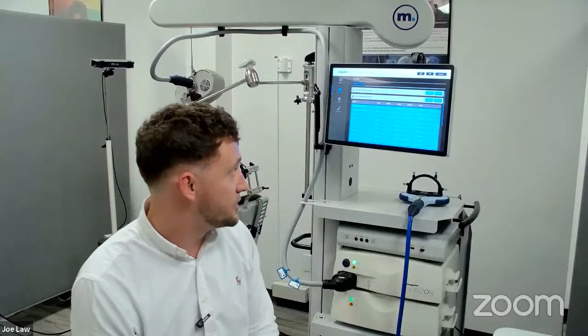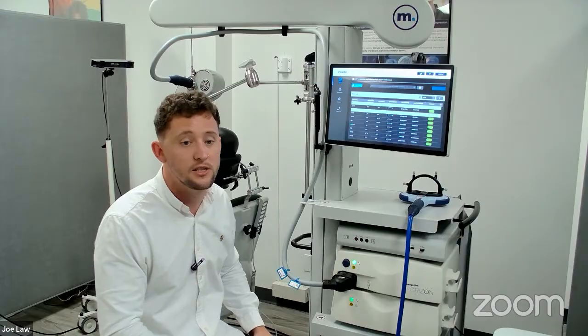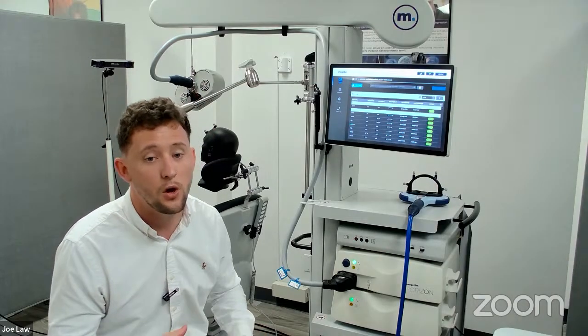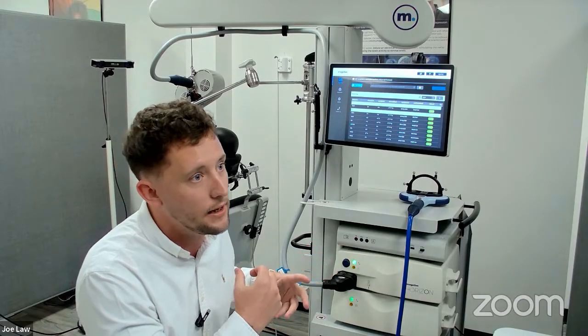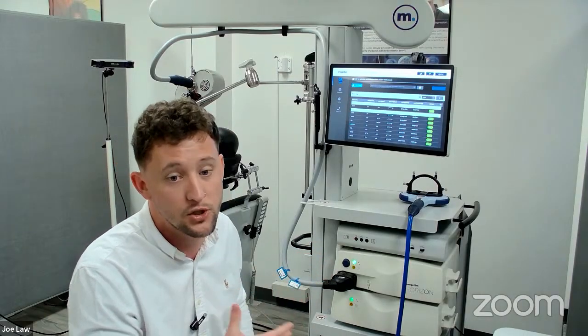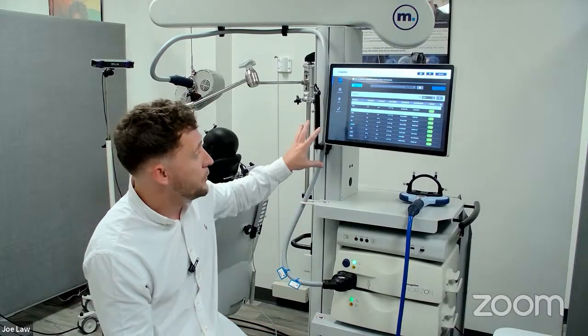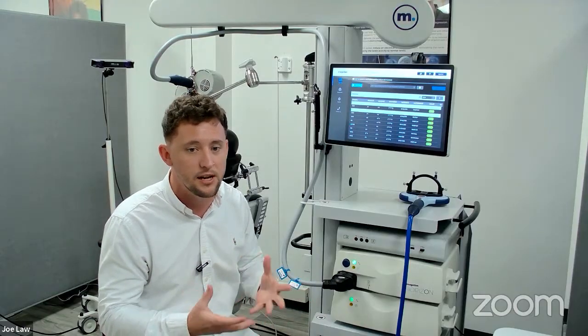If I have a problem with my system, Joe, and I call you, can you remotely diagnose what the problem is? I can indeed. So with this system, it is in the back end, it is Windows based, so we can remote in. For regulation purposes, we obviously need approval from you, and you would actually have to provide us a generated password which changes constantly, so we can't get in the system without your approval. But if you give us those credentials, we can log in, we can check the logs and see how the system has done over time.